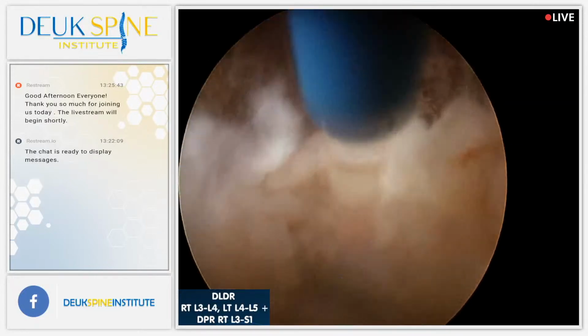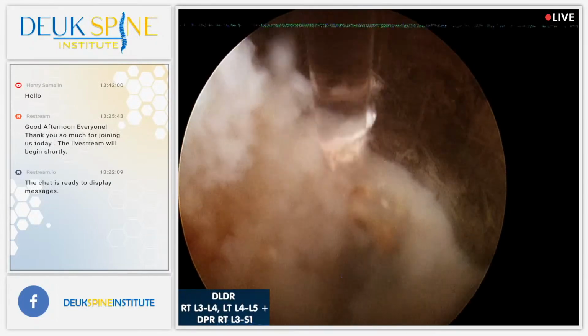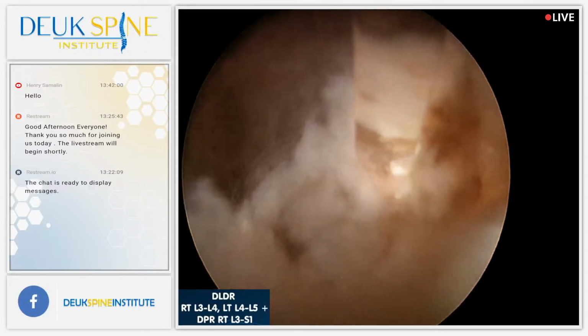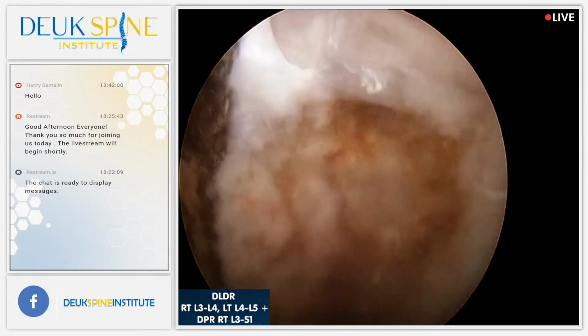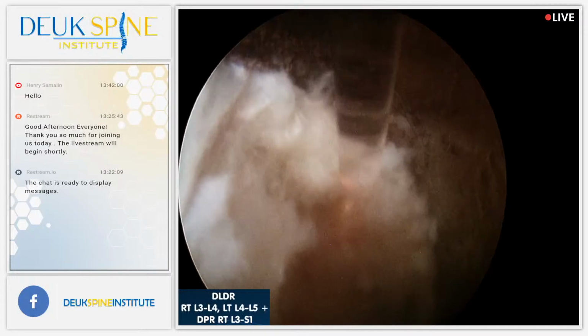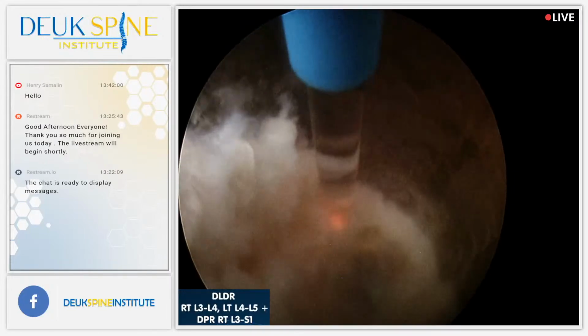This patient came to us with horrible back pain right at the L3-4, L4-5, kind of L5-S1, but more to the right side, which is the side I'm on. And when I did my exam of him, I noted that not only did he have problems with pain coming from the discs, but definitely he had facet pain.